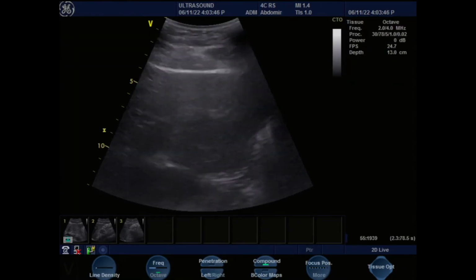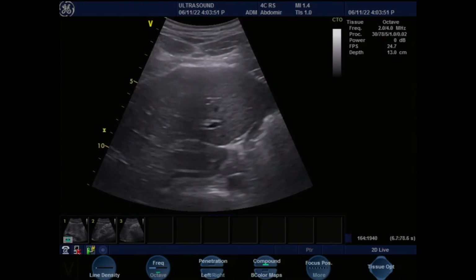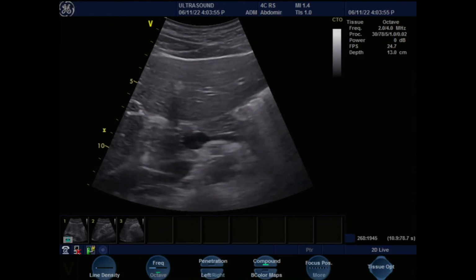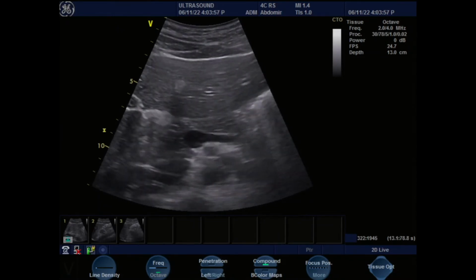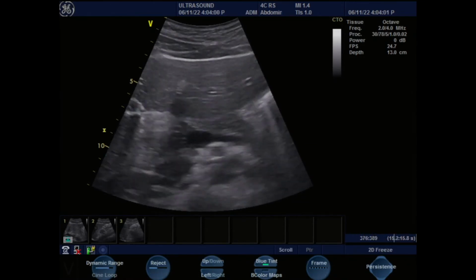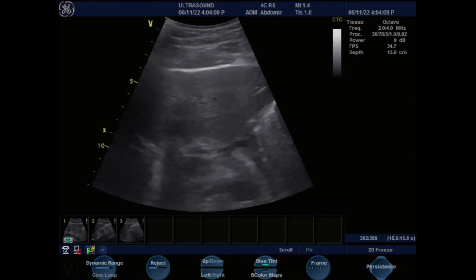So Hussain, if I push your belly out, press the belly out. Yes, reach over, freeze down. Excellent there. Okay, we can unfreeze and we can move forward to the gallbladder.